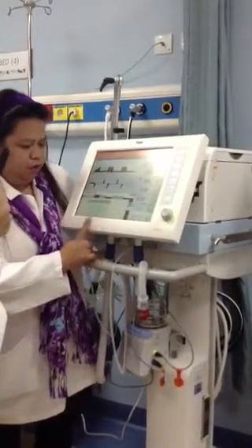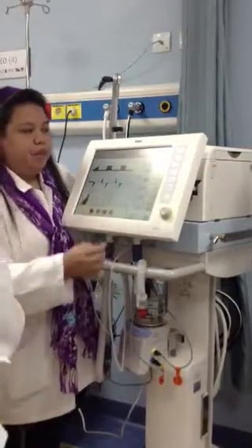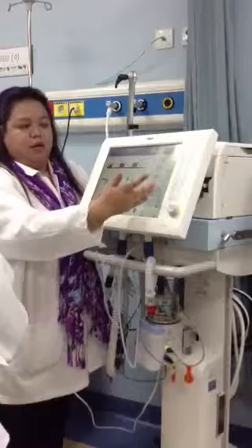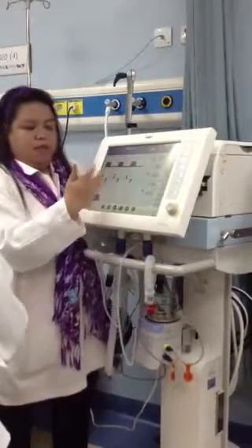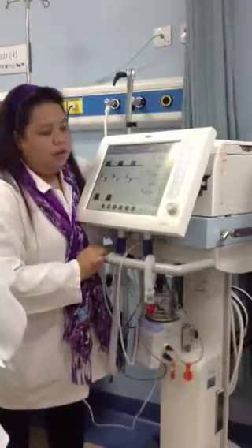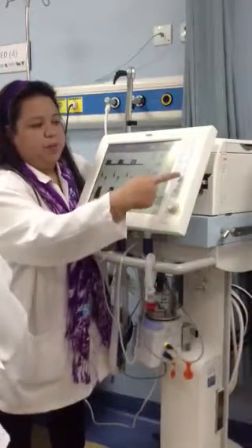Your auto flow trigger. You can see your patient's parameter here. This is the one coming from your patient. And this is the slope, if somebody can read the waves of the breathing. And you have your sensor parameter.